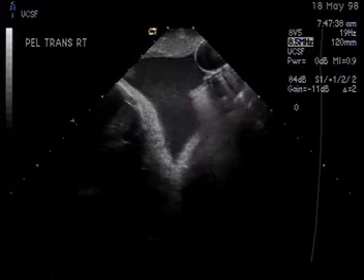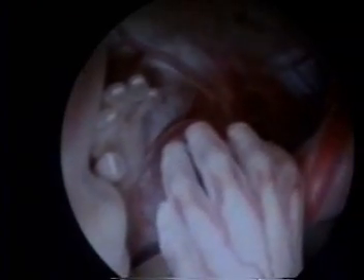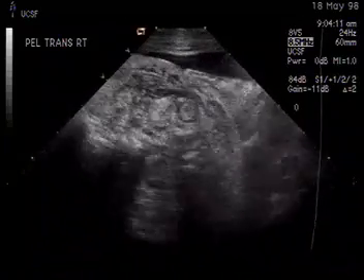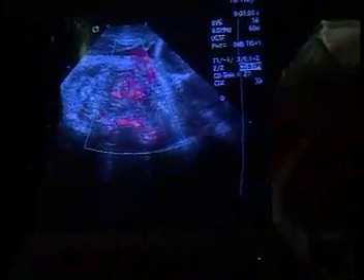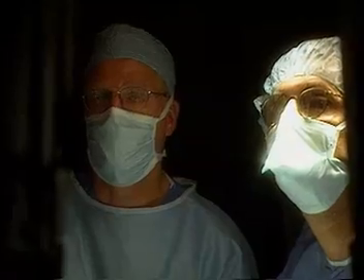The procedure is half endoscopic and half sonographic. We have two screens, and they're both real-time. One of them is showing the view through the telescope, looking at the kid's hands and face and all — it's very, very pretty. And the other is the sonogram, just like the one that you've seen before — a cross-sectional image, a cut through the kid — and we're doing them continuously and simultaneously. That's how the procedures get done.